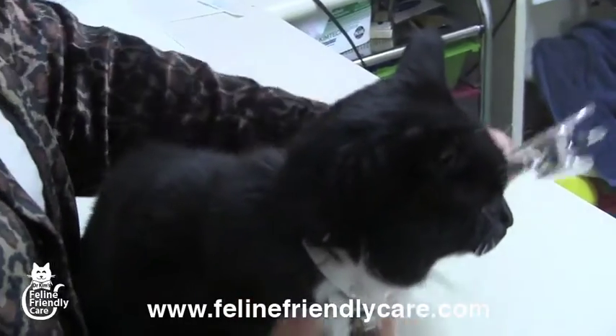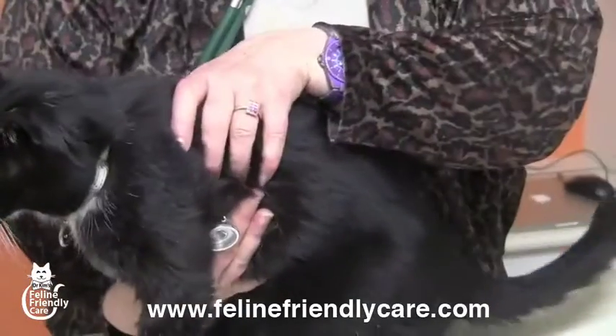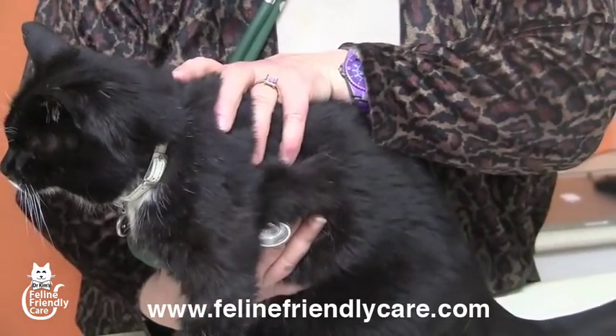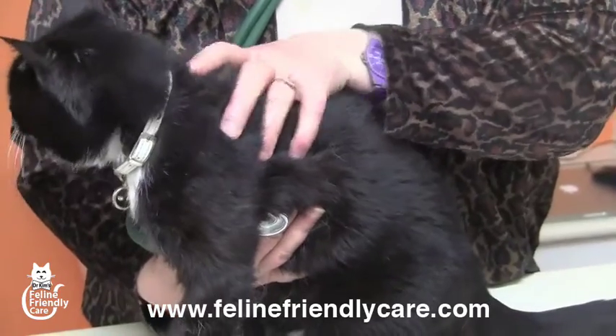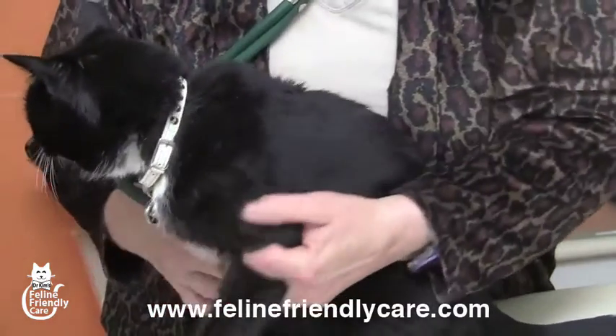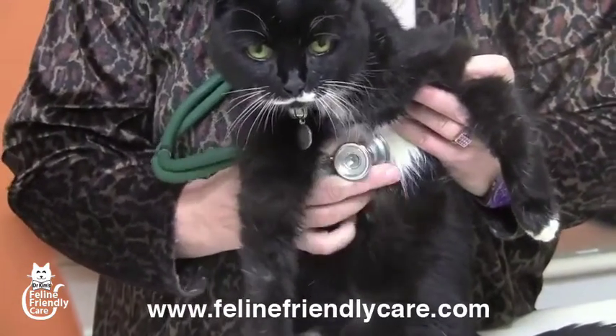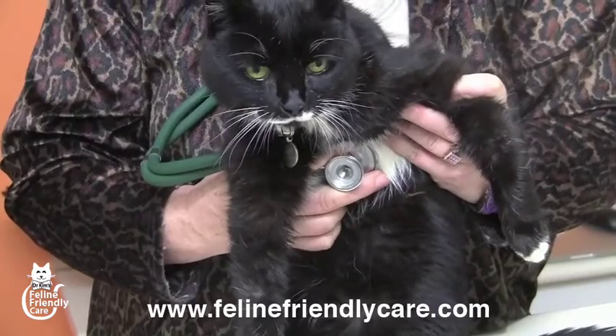I'm going to listen to her heart, because that's one of the things we always do. This is the position you'd hold the stethoscope if you're listening to a dog's heart — just behind the elbow. It's not terribly useful in cats. The position for cats is here, under the sternum, just where the ribs end.